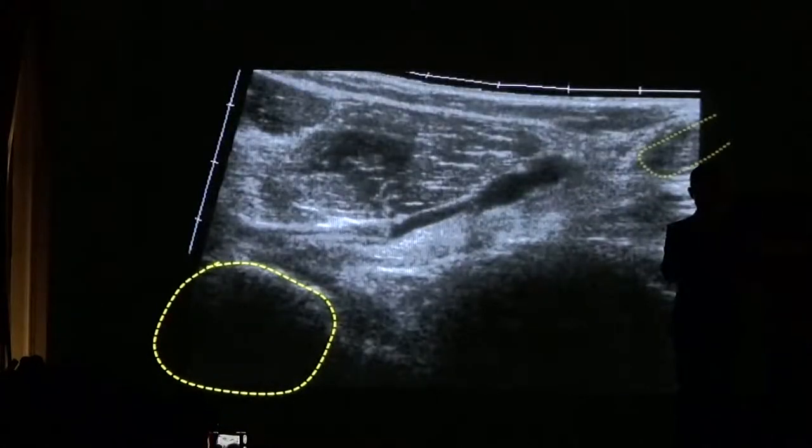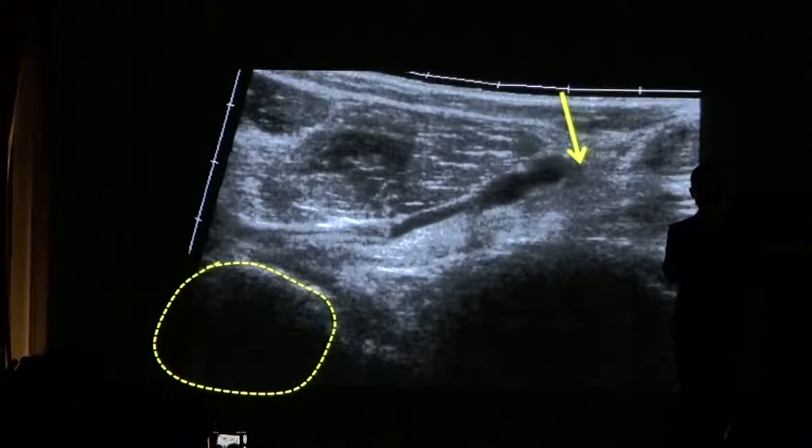This is an example of someone who has a disrupted biceps tendon. That's where it should be attaching, and there's a gap up to the retracted tendon.